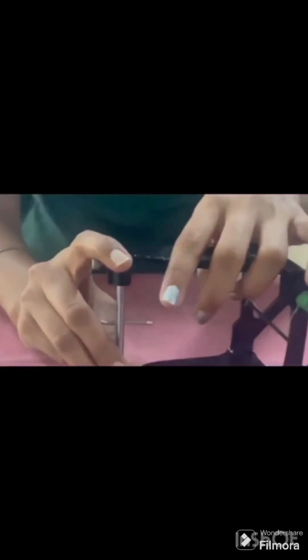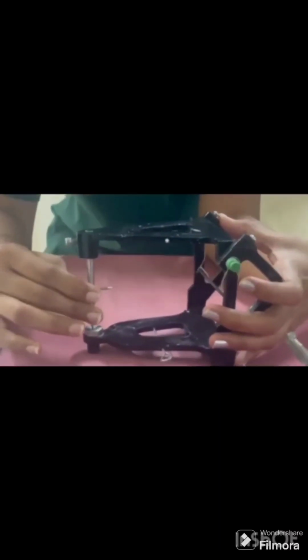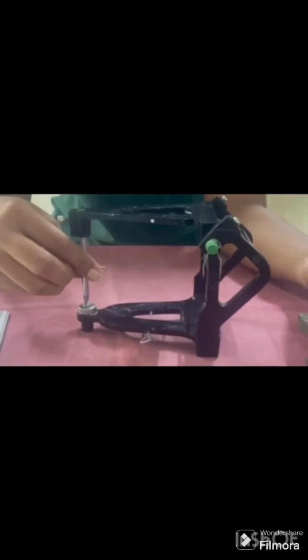Coming to the limitations of the articulator, it is subject to errors in tuning and errors resulting from metal fatigue and wear. No articulator can exactly duplicate the condylar movements of an individual. It cannot compensate for any errors in jaw relation records.